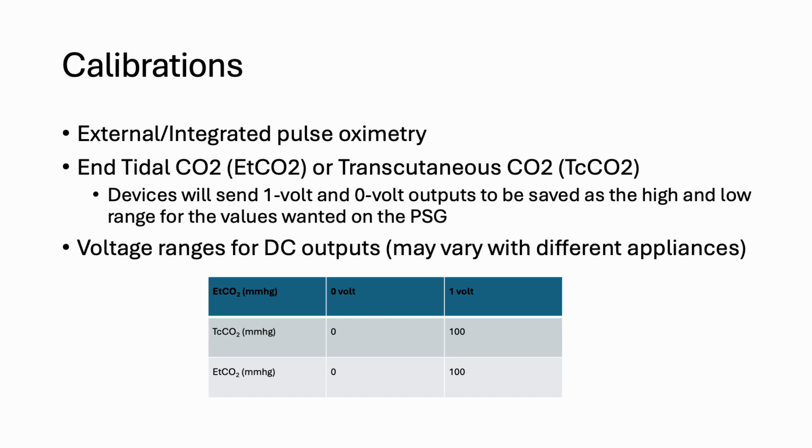When the patient has the pulse ox on, the pulse ox unit reads the oxygen level as an analog signal and translates that into a voltage like 0.973 volts, which would maybe translate into the PSG system as 98%. The same occurs for CO2.